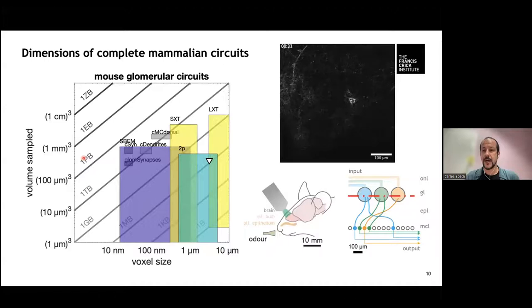So for instance, if we start our experiment doing in vivo imaging of a glomerular plane, like in this diagram here with an anesthetized mouse presented with odors of different nature, up to 50, or 48 actually, in this particular experiment, while we image that glomerular plane with two-photon imaging at the layer that here I'm showing in red, we would see a map of this kind. And this approach could already tell us, as we see different places that are flashing, how different circuits or neurons are preferably activated by certain stimuli.